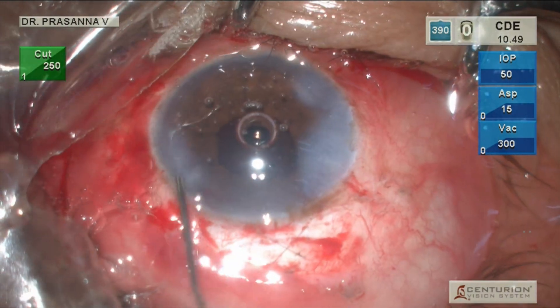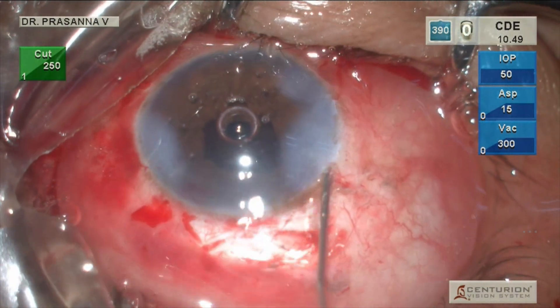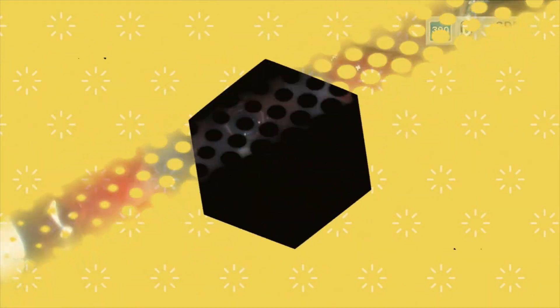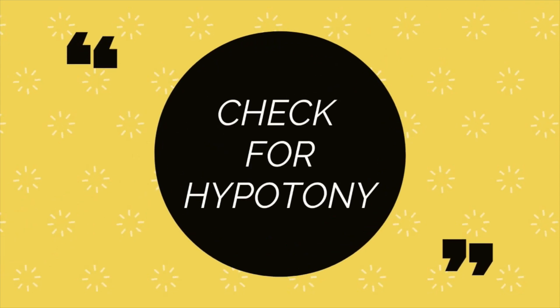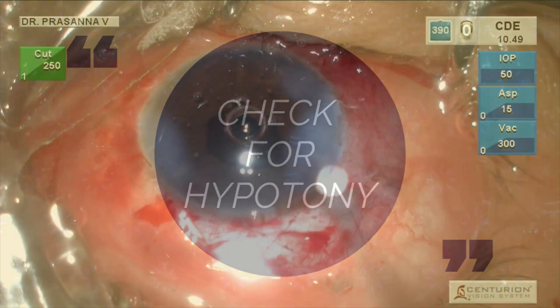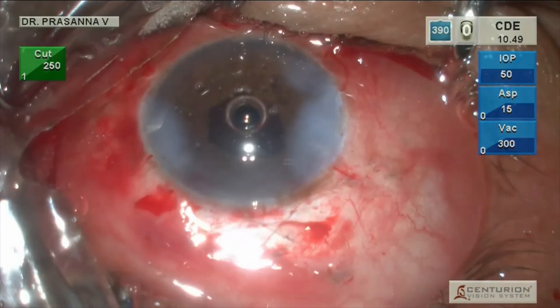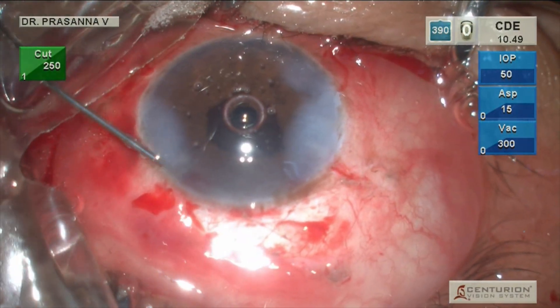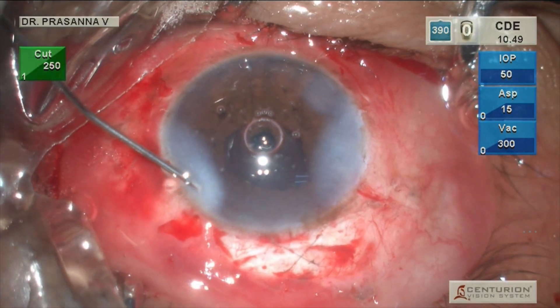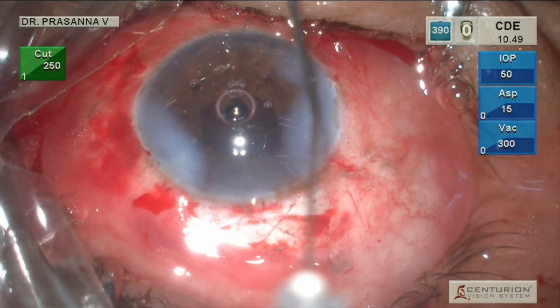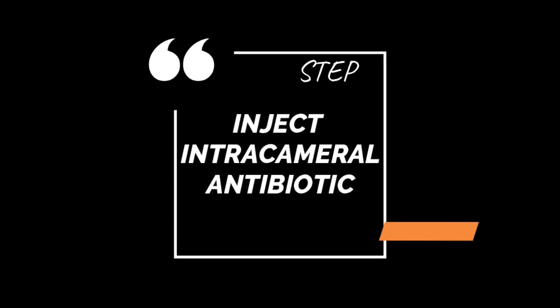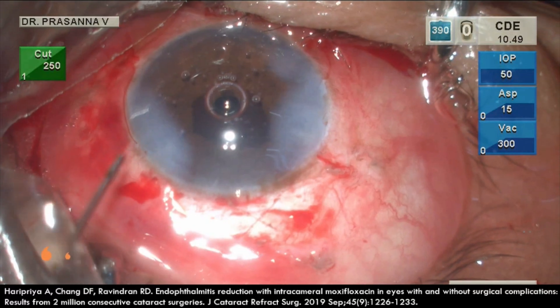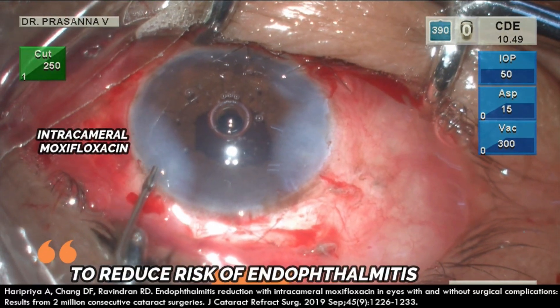Finally, hydrate all wounds and make sure all the ports are watertight. We do not want hypotony in an eye with a compromised posterior capsule. We recommend using intracameral moxifloxacin in all eyes with compromised posterior capsule to reduce the risk of endophthalmitis.